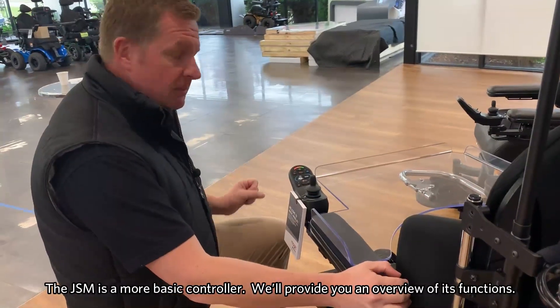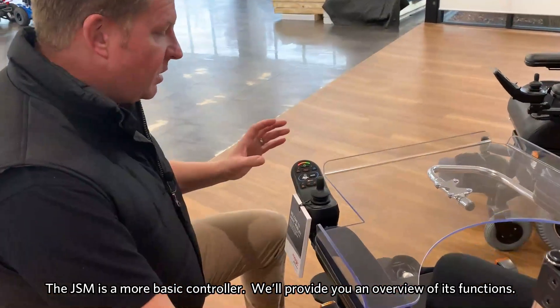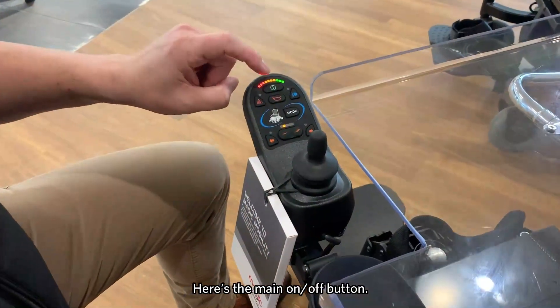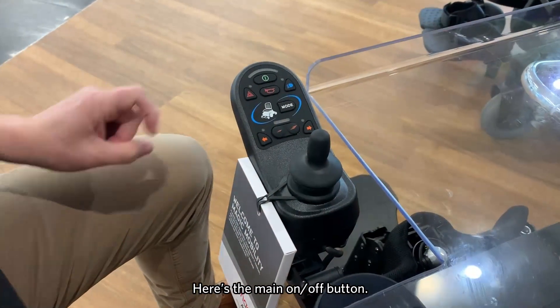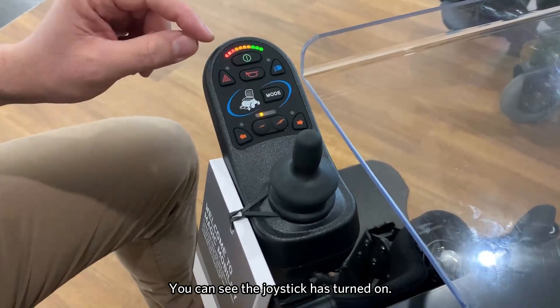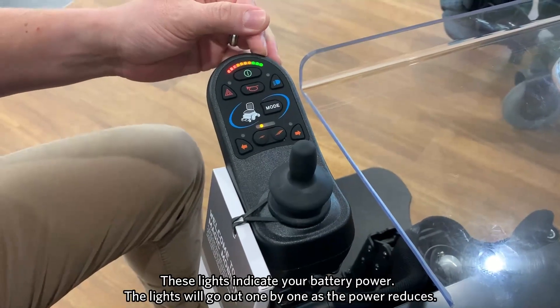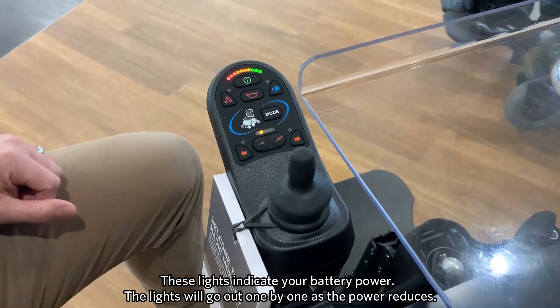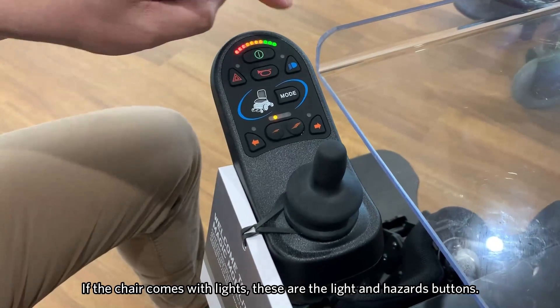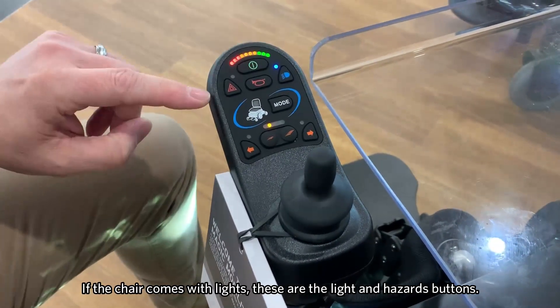First, I want to speak about the JSM, which is our more basic controller on our chairs, and give you a basic overview of the main functions. Here we have the main on-off button — if I press this button and press it again, you can see that the joystick has booted up. These lights here indicate how much power is on the batteries, and these lights will go out one at a time as the power reduces. We have the horn, and we also have some functions if the chair comes with lights and indicators — so we have the lights here, and then we also have hazards.